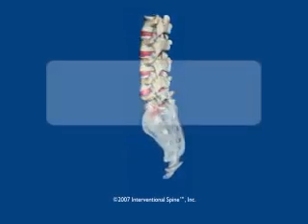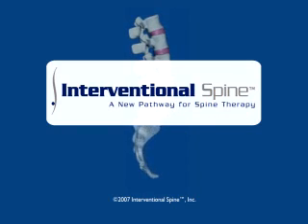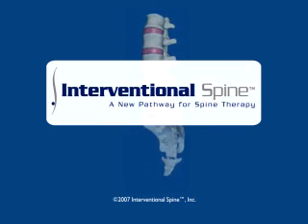In summary, we believe the PERCUTANEOUS system allows surgeons the least invasive means to provide posterior lumbar stabilization in the market today. This means less trauma and pain for the patient while providing comparable fixation of the spine as compared to more invasive rod and screw technology.